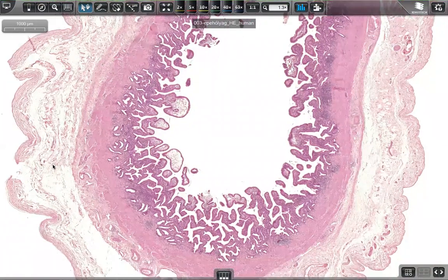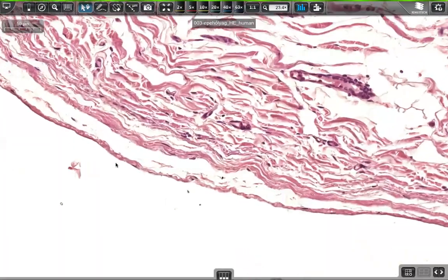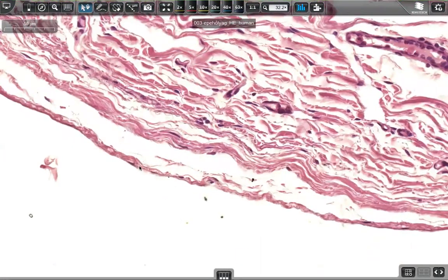If we can find a really sharp covering externally, that is a serosal covering. The gallbladder posteriorly is covered by peritoneum, therefore it represents serosa, and the side which faces the liver isn't covered by peritoneum, so it represents adventitia. So now we are looking at the peritoneal covered side.